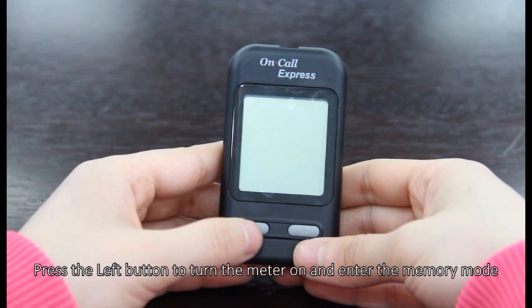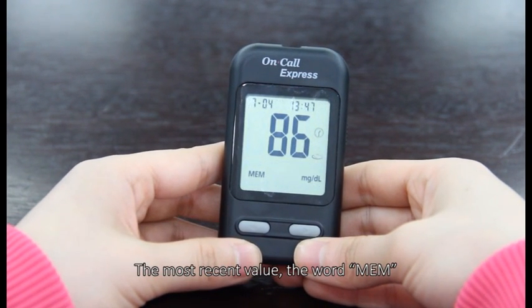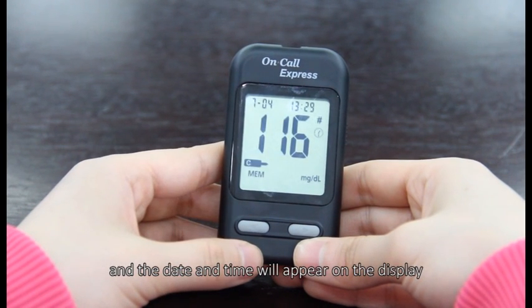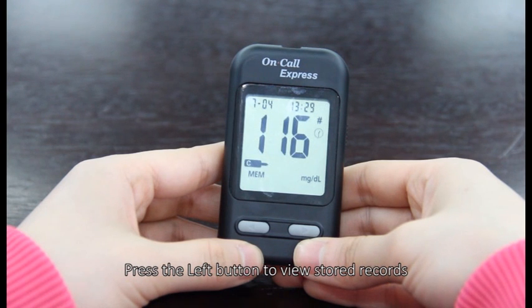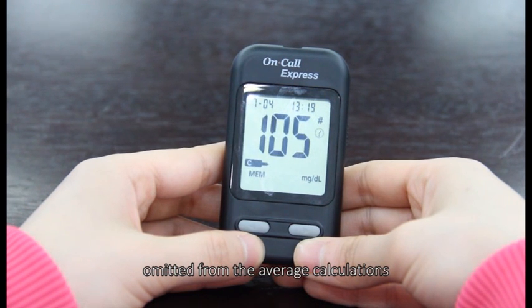Press the left button to turn the meter on and enter the memory mode. The most recent value, the word memory, and the date and time will appear on the display. Press the left button to view the stored records. A pound sign indicates the record will be omitted from the average calculations.